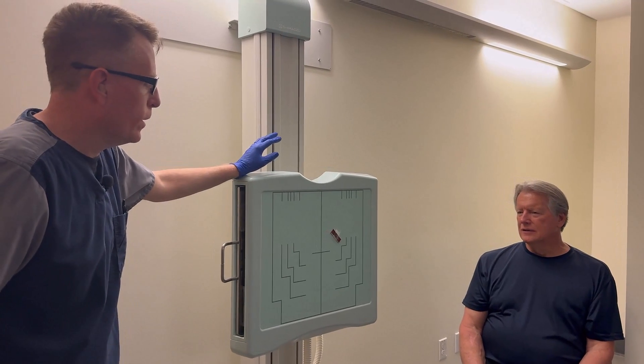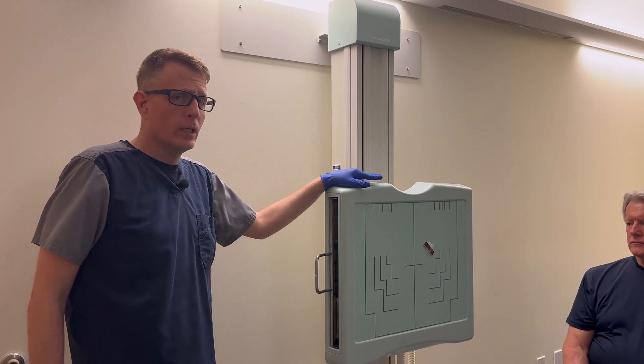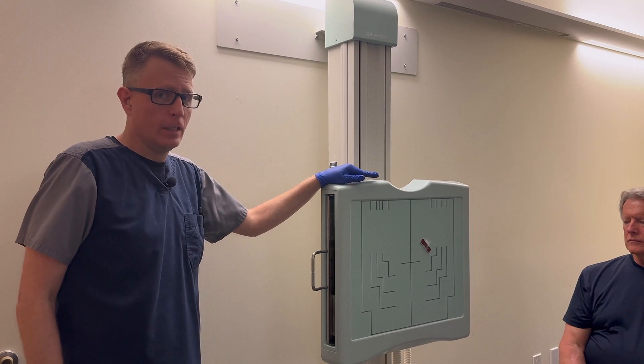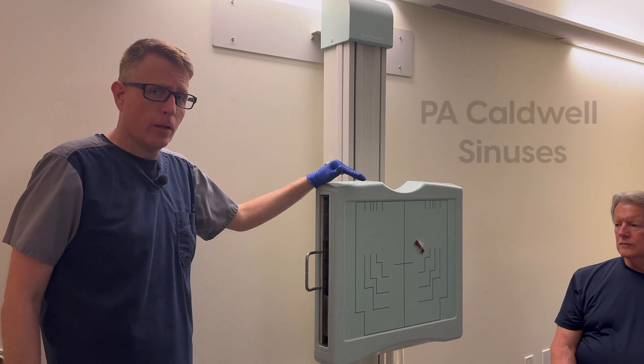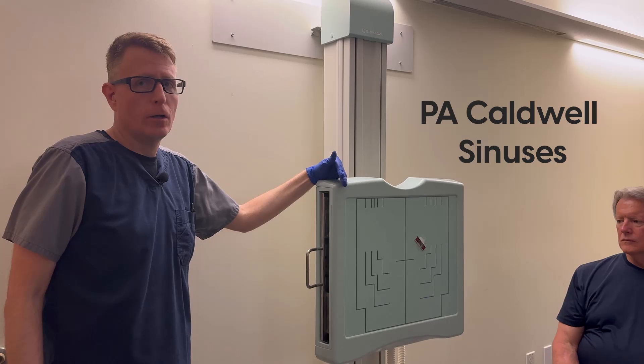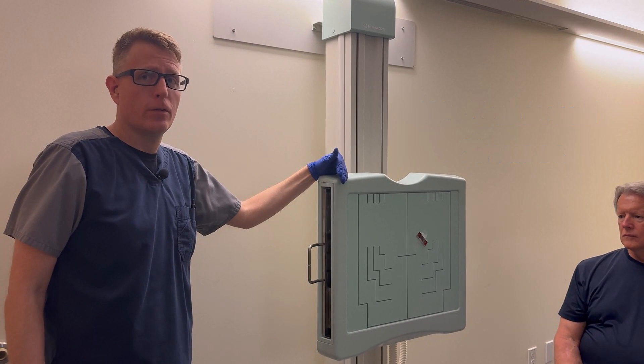The most important thing to remember on a sinus series is you never want to angle the tube. You want a horizontal beam to show air-fluid levels in the sinuses. So for a PA Caldwell, where you would expect a 15-degree caudal angle, we're going to use a horizontal beam, which means we're going to adjust the patient instead.